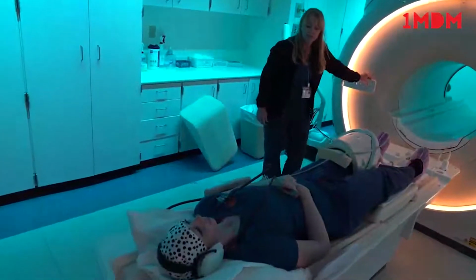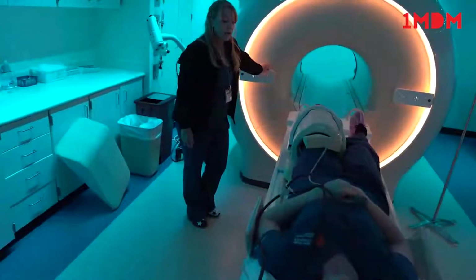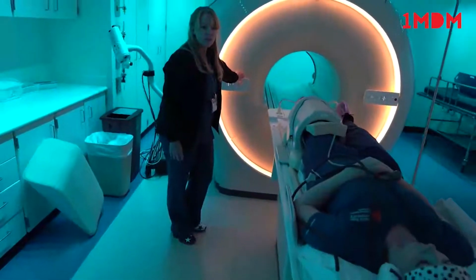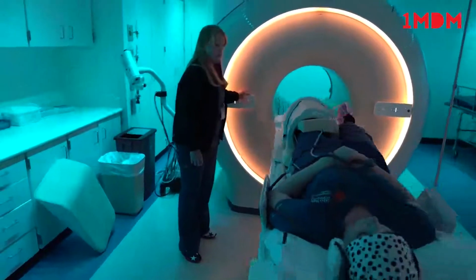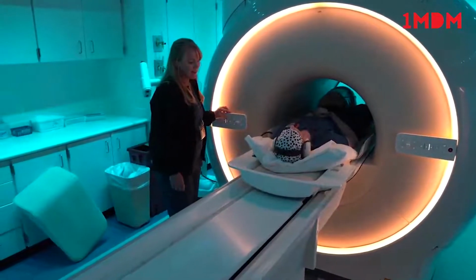Okay, we're going to put you up and in. Once I get you there, I'm going to ask if you're okay. You tell me you're okay, I'll start the music and walk out and start your scan, okay? Okay. So right there is where you're going to be. Are you okay? Yeah, I'm okay.